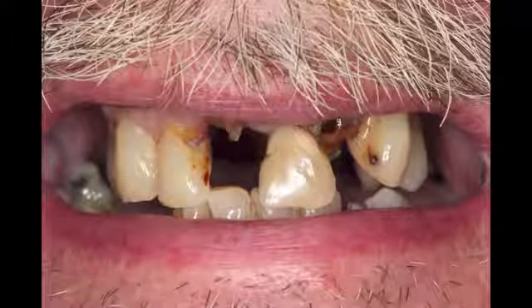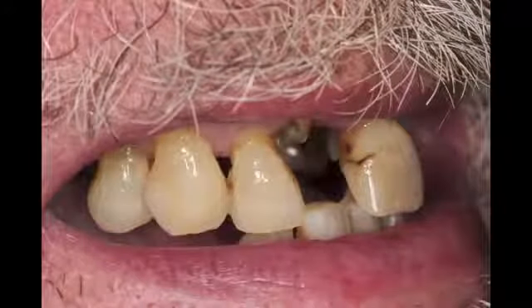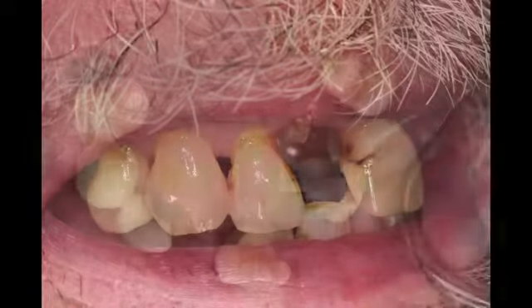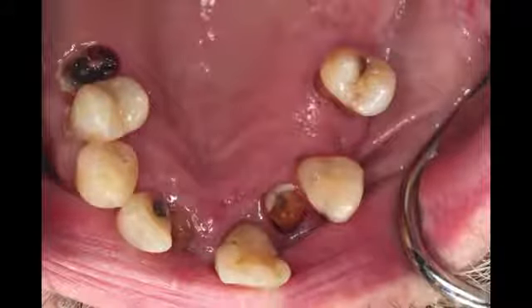But our intent is to atraumatically remove the grossly decayed teeth and strategically place 4 dental implants and seat a maxillary transitional removable appliance that has the palate removed. So the transition will be easier for the patient to accept. If we remove all the teeth, then the patient would need to be in an immediate denture, which sometimes can be psychologically and physically difficult for them. So I find giving them a palateless appliance is a nice transition. We'll remove the last 2 remaining teeth after healing.